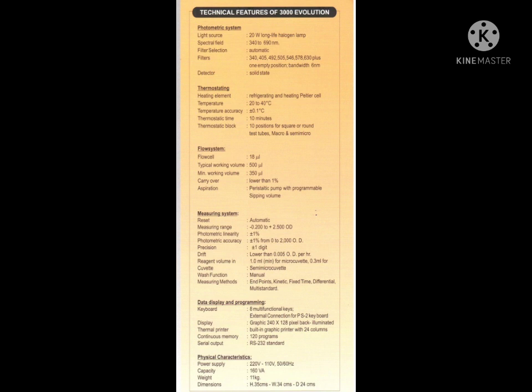Thermostating heating element is almost the same as other analyzers. Peltier system is maintained. Thermostatic time 10 minutes.